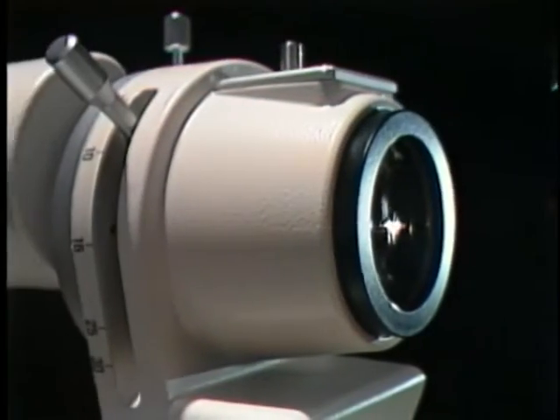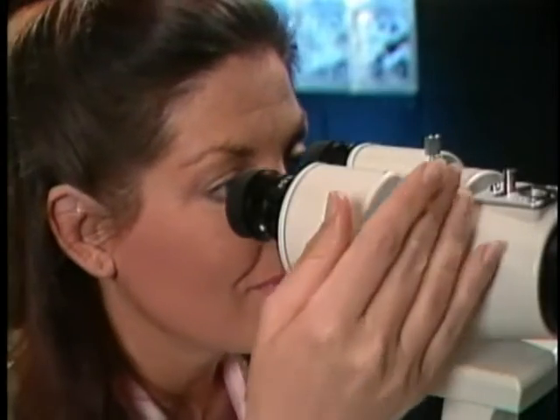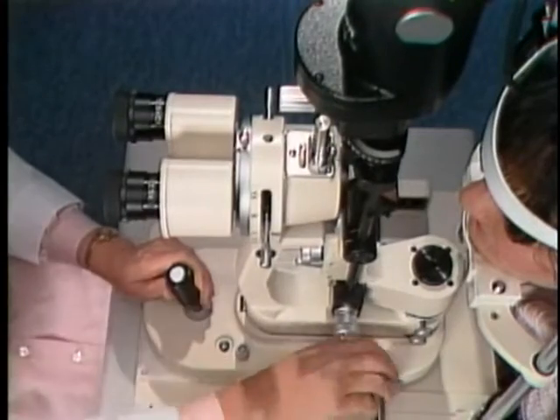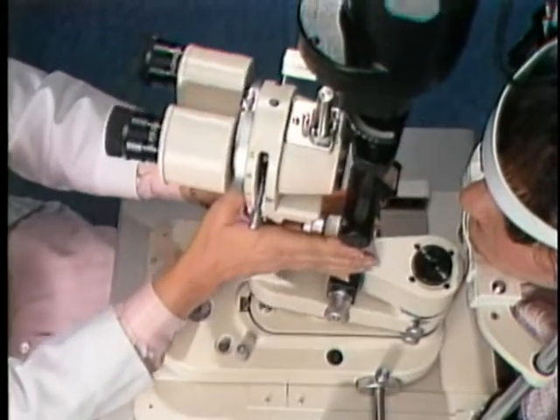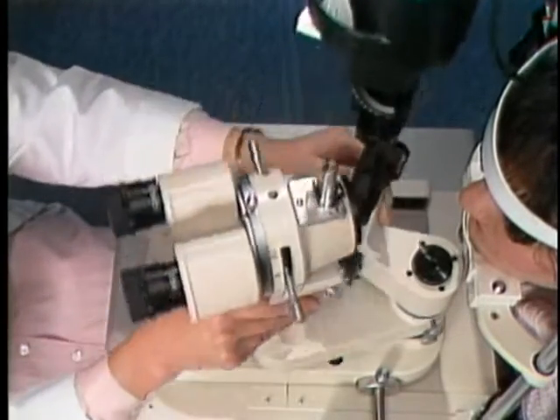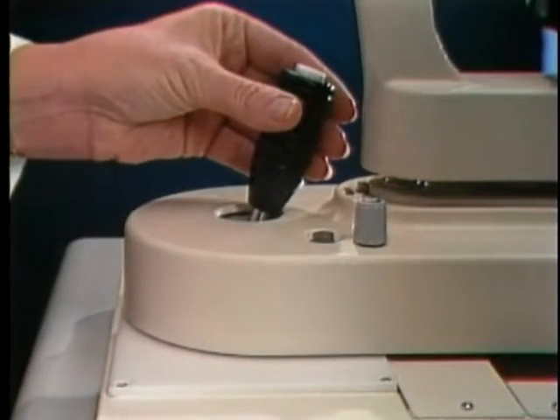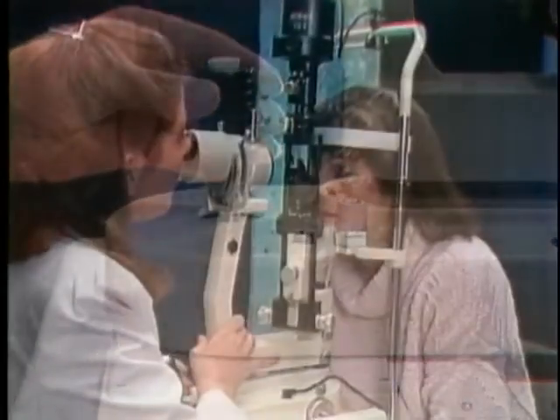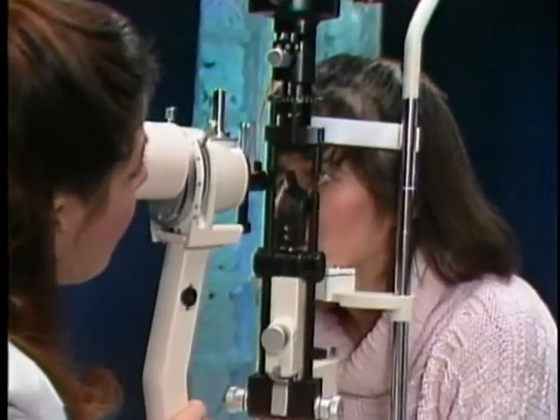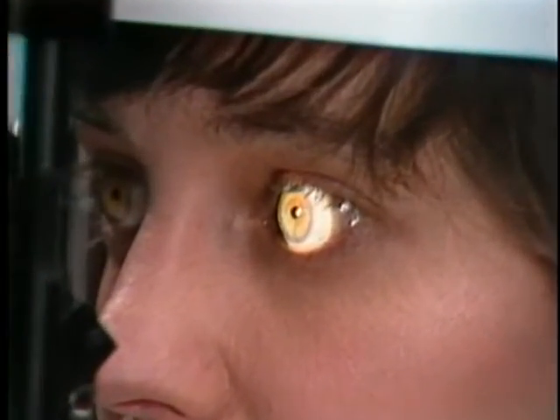The microscope provides a stereoscopic image at varying powers of magnification. It consists of eyepieces and a magnification changer. Both systems are joined on a movable platform and rotate about a common axis, as a single unit, or moved independently. A joystick controls vertical, forward-backward, and right-left adjustments. By changing the position of the light source and microscope, various illuminations are produced, enabling any part of the eye to be evaluated.